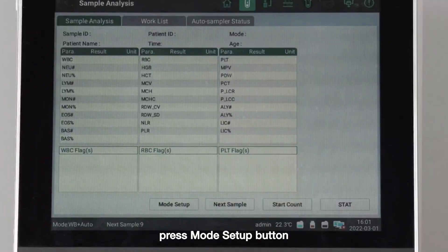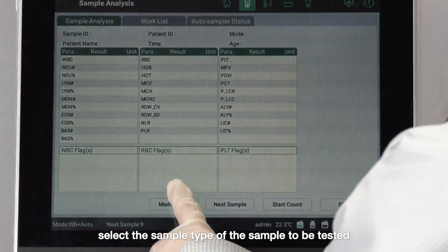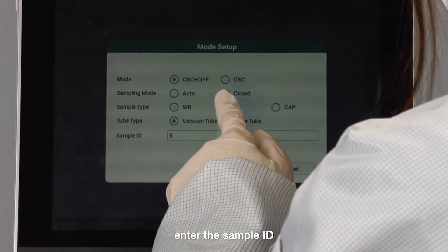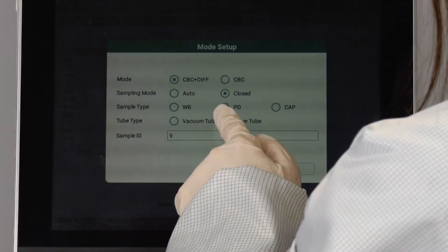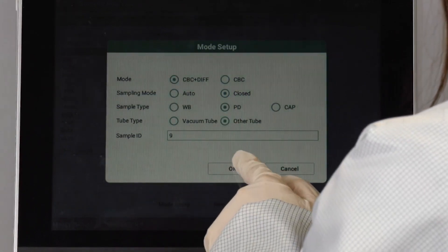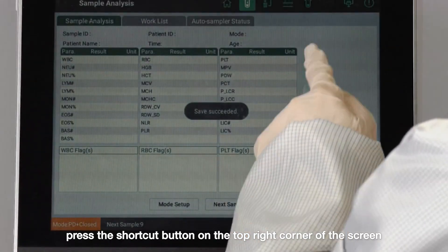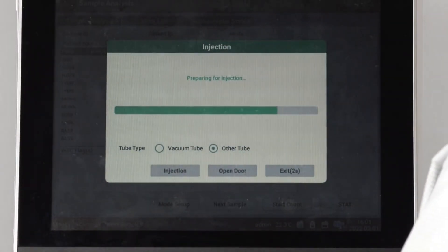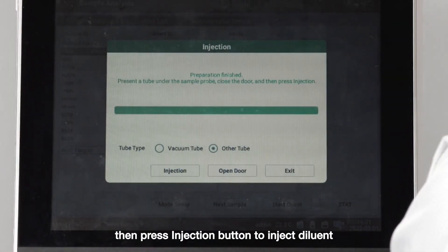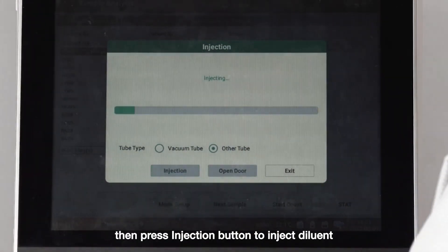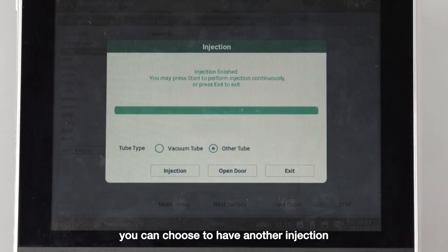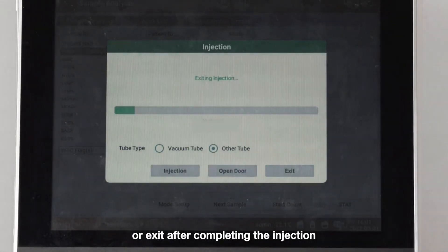Press the mode setup button, select the sample type to be tested, and enter the sample ID. Press the shortcut button on the top right corner of the screen, then press the injection button to inject diluent. You can choose to have another injection or exit after completing the injection.